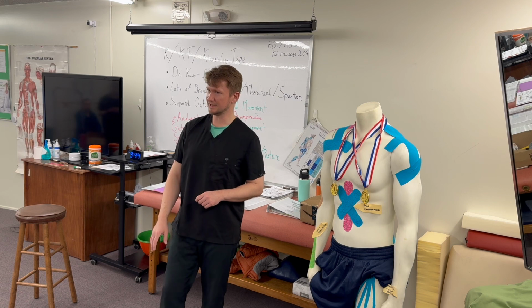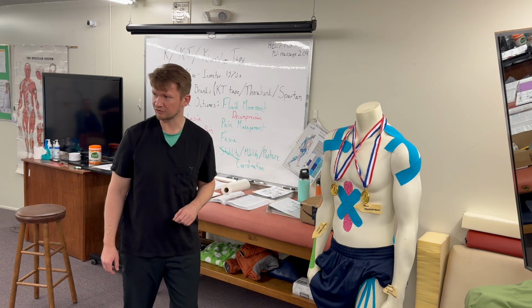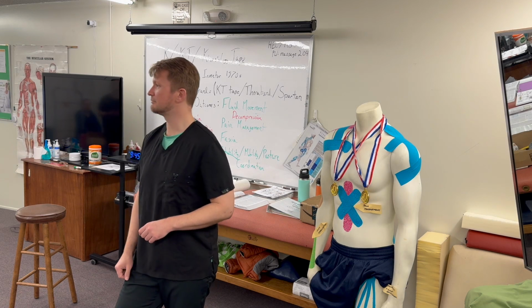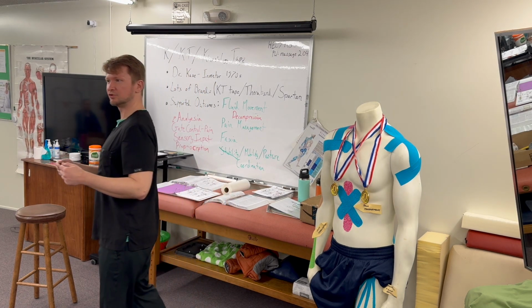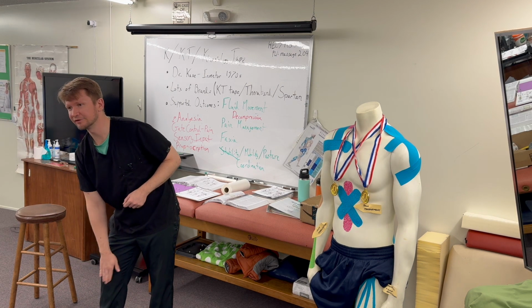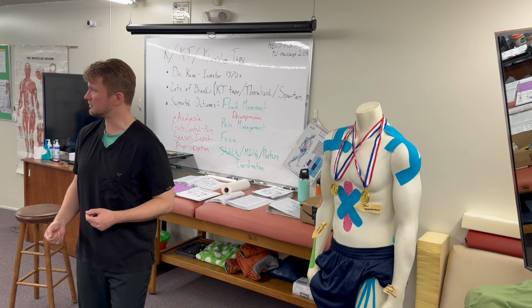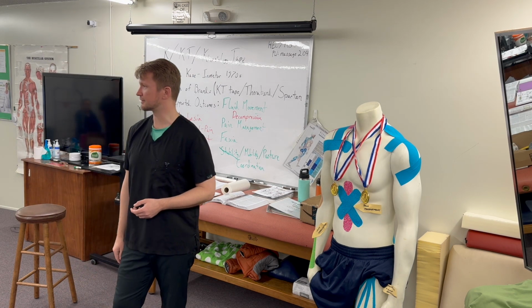for knee extension, and a lot of time will get spent in rehab trying to strengthen that muscle using bands and all that. I could put tape on top of that muscle while telling the person our goal is, when we do this exercise, to engage here. Now there's this extra bit of sensation, maybe helping function as a reminder and a cue that as they do this movement, they're getting a more isolated contraction of that particular muscle.